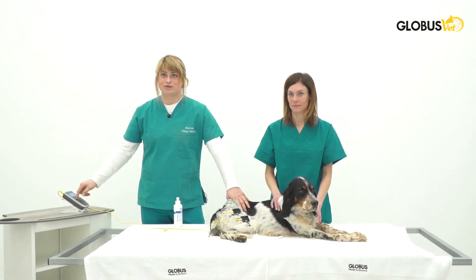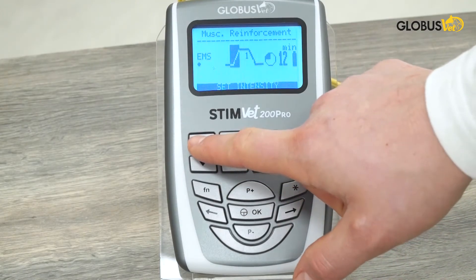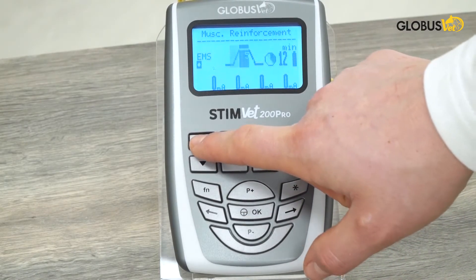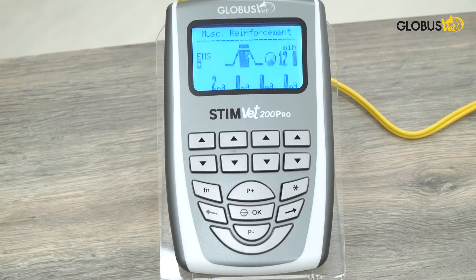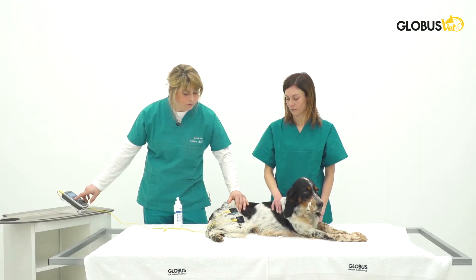Always make sure the patient is not in discomfort. After placing the electrodes on the patient, let's go and turn the intensity up. Always check for patient discomfort and make sure the electrodes are rightly placed. When we turn, we should see muscle contracture.